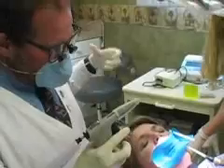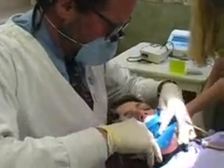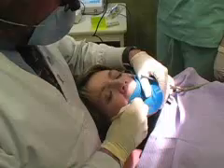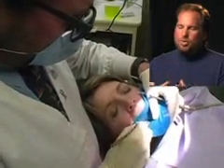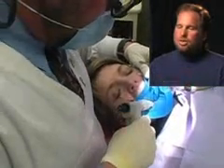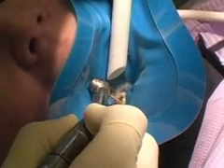After we do that, I'll use the same material — that rubber gutta-percha — in a gun, and that's what I'm doing now: filling the rest of the root canal system with the rubber. When you do a root canal, it's like taking the core out of an apple, and when you put the gutta-percha in, you're putting an artificial core back into the tooth. I'm cleaning all the excess gutta-percha off now, making sure it's clean inside — and it looks good.